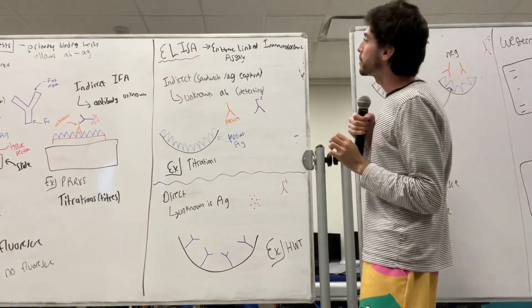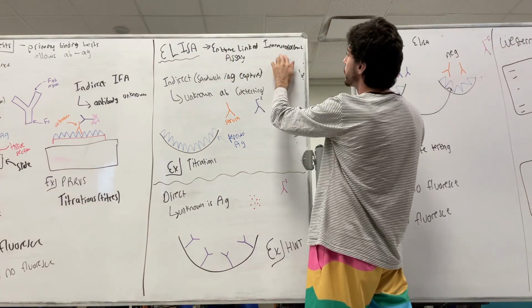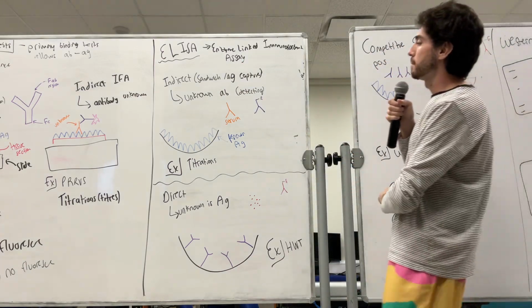Okay. So the next test is the ELISA test, which I'm sure a bunch of you are familiar with. It stands for enzyme-linked immunosorbent assay. And the first one that we're going to look at is our indirect one.